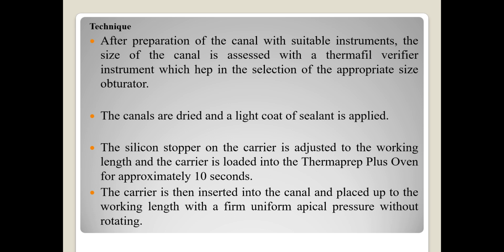The technique involves, after preparation of the canal with suitable instruments, assessing the size of the canal with a Thermafil verifier instrument, which helps in the selection of the appropriate size obturator. The canals are dried and coated with sealant. The silicone stopper on the carrier is adjusted to the working length, and the carrier is loaded into the ThermaPrep Plus oven for approximately 10 seconds.